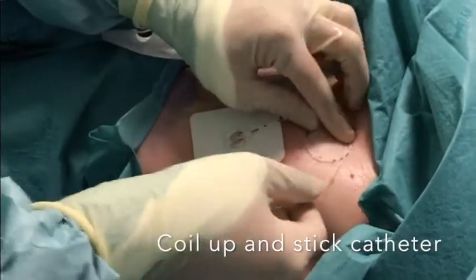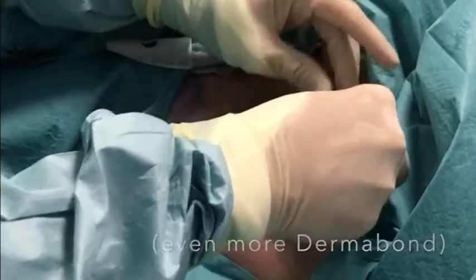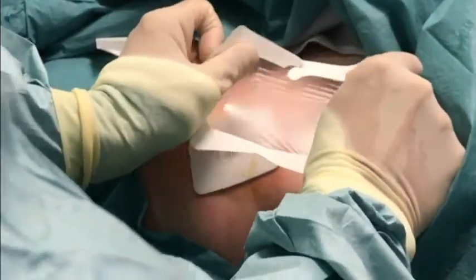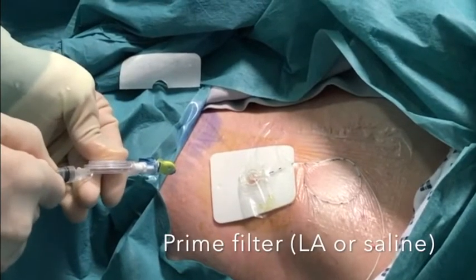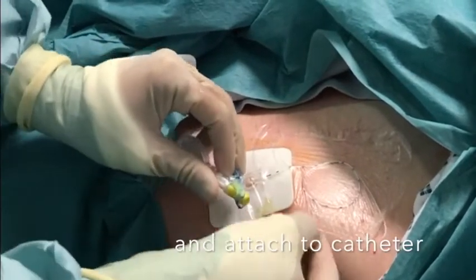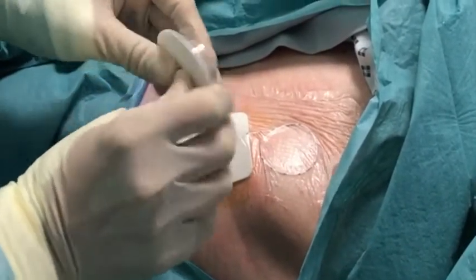Coil up the catheter and stick this down onto the glue. Take a clear adhesive dressing and use this to cover the catheter coil and the exit out of the side of the catheter from the skin. You may need more than one dressing to cover the whole area. Assemble the clamp and filter and prime this with sterile local anaesthetic or saline. Connect the catheter into the clamp. Open the fixer long device and click the shell part onto the bacterial filter, then click this into the adhesive part of the fixer long device.